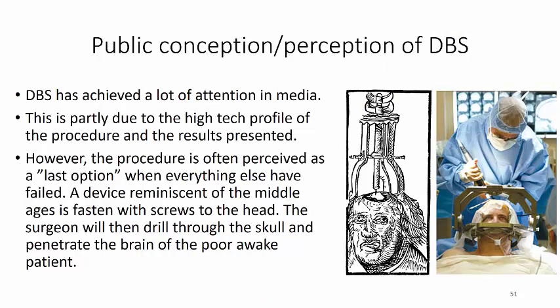We then have the public conception of DBS. DBS has achieved a lot of attention in the media, and this is partly due to the high-tech profile of the procedure and the results presented. However, the procedure is often perceived as a last option when everything else has failed. A device reminiscent of the Middle Ages is fastened with screws to the head. The surgeon will then drill through the skull and penetrate the brain of the poor awake patient.